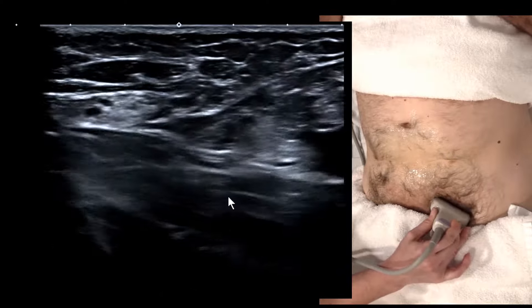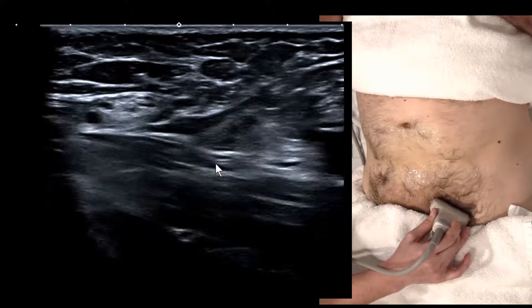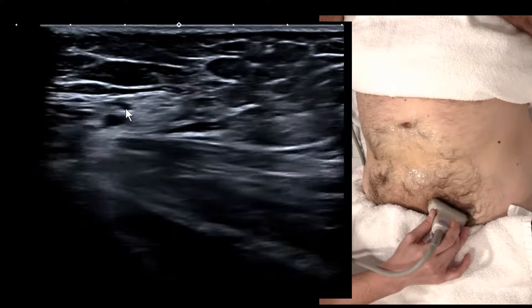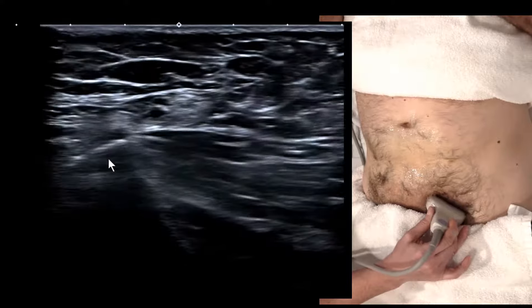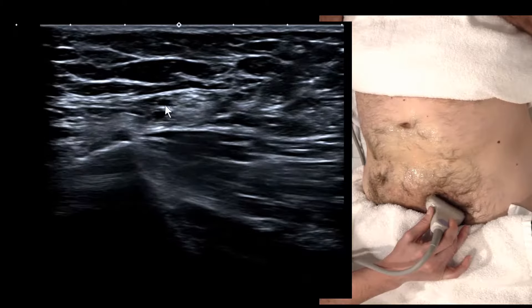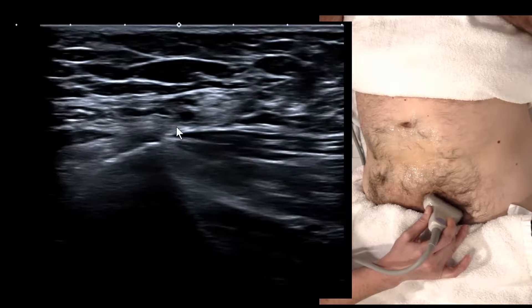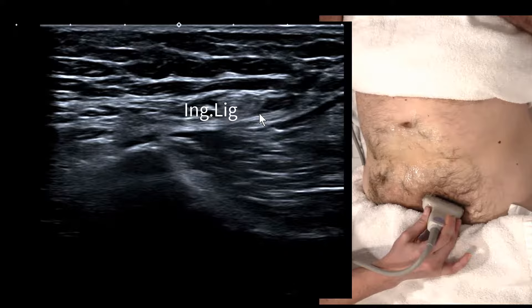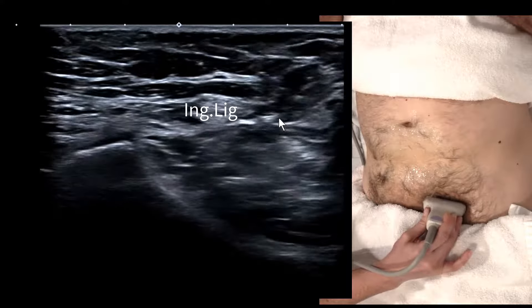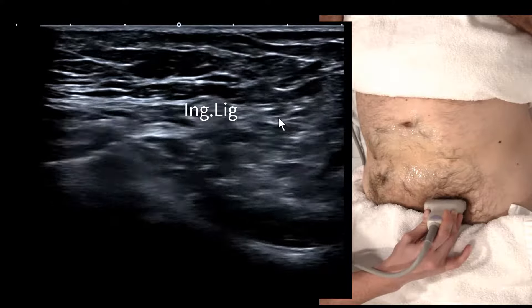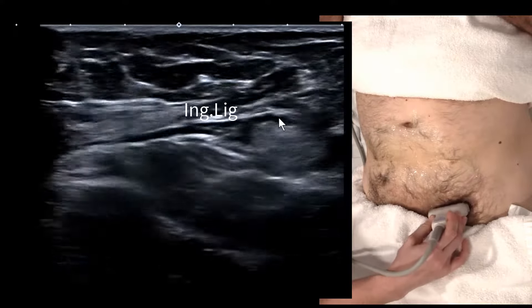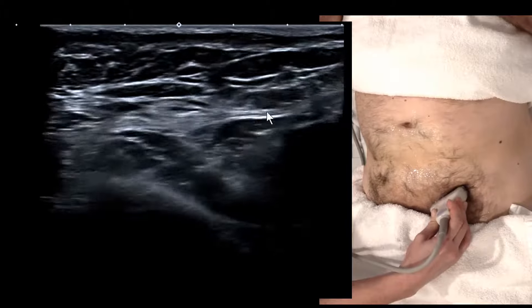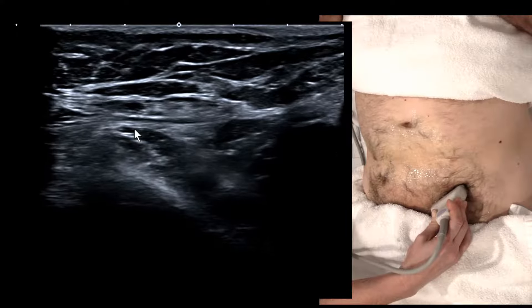While performing that Valsalva we could see something move over here. This is back at the pubic tubercle — here's the spermatic cord, immediately supralateral. Now we look at the inguinal ligament by rotating the camera to point from the pubic tubercle to the ASIS. There's the inguinal ligament.